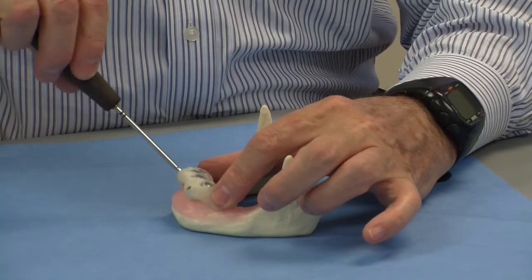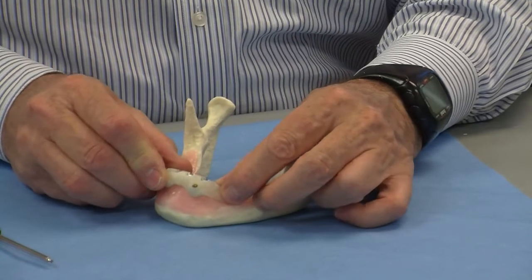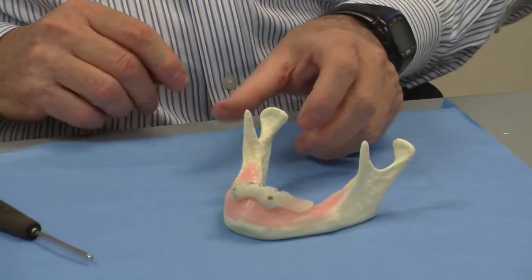The tightness of the screw can be adjusted in order to have a very rigid fixation.